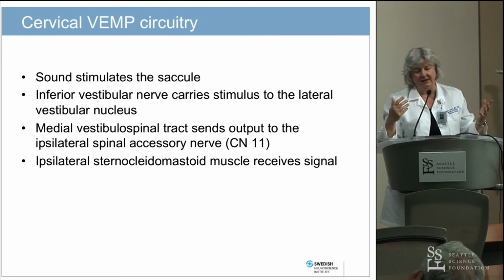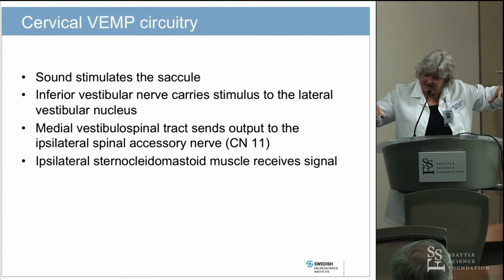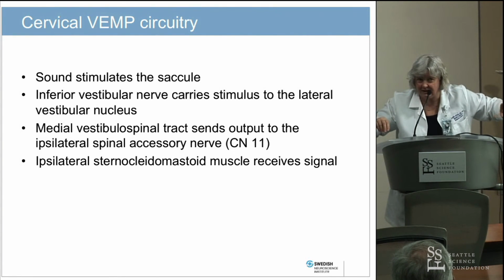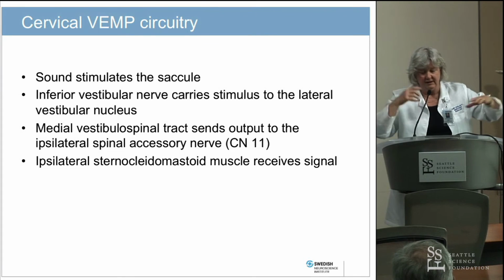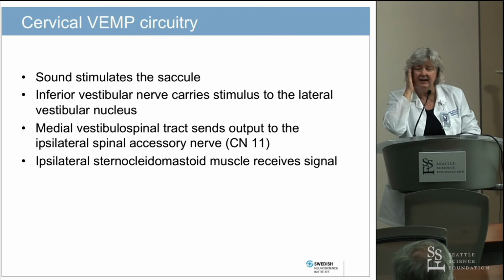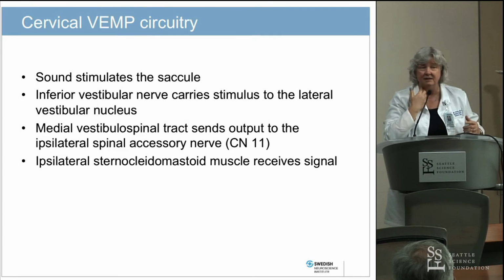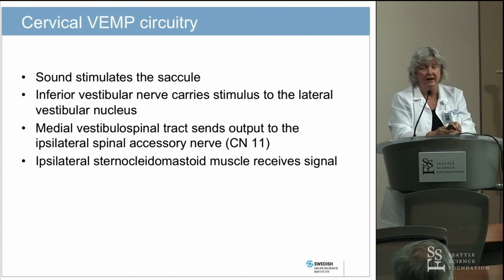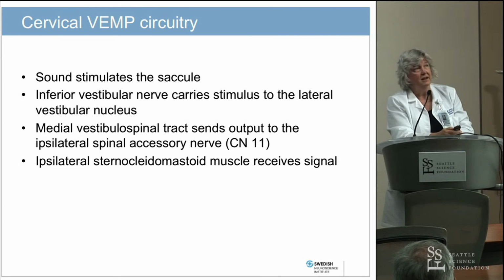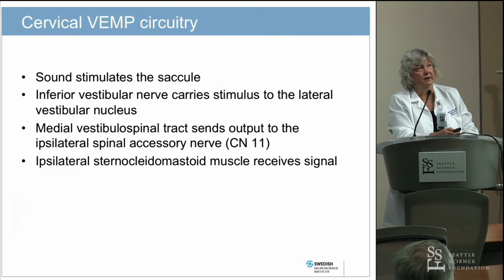People have tried all kinds of stuff, having the patient lay down, lift their neck up, hold it, keep holding it for like 15 minutes. Very hard for older patients. Plus you need a bed. Or then they tried, okay, let's turn your head and push this water bottle against the wall. Don't let it drop. Again, it's kind of hard to sustain your neck contraction that long. So there's a lot of noise that enters into your VEMP recording.